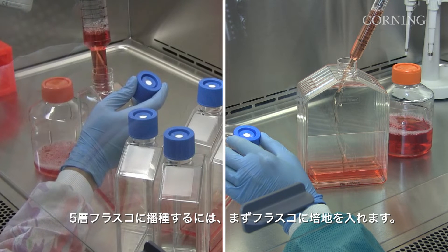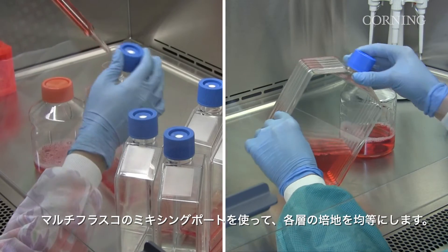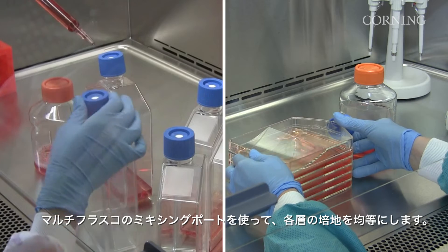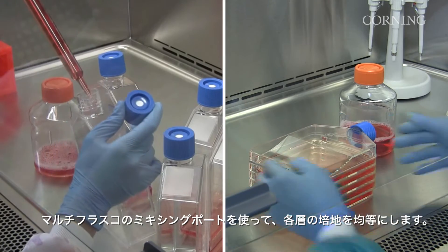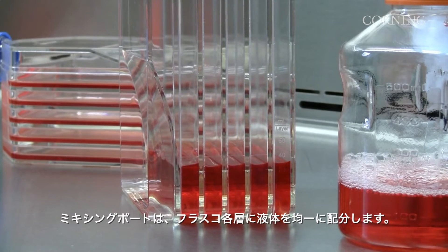To seed the five-layer flask, you simply add the media to the flask. Equilibrate the media across the layers using the Multiflask's unique mixing port. The mixing port creates an even distribution between the layers of the flask.